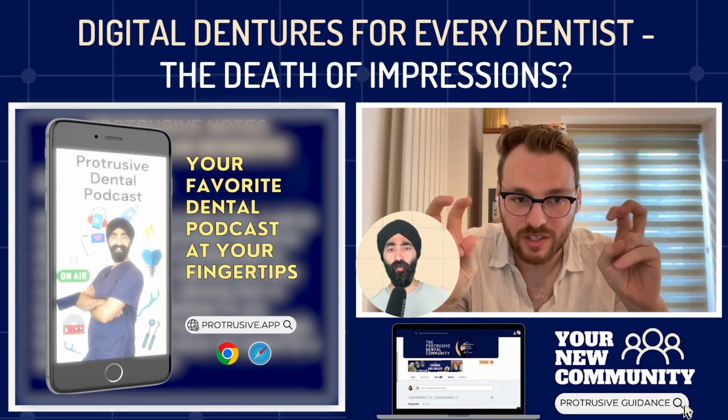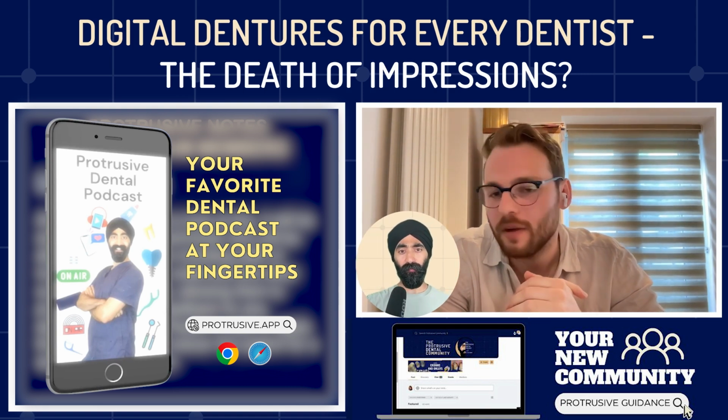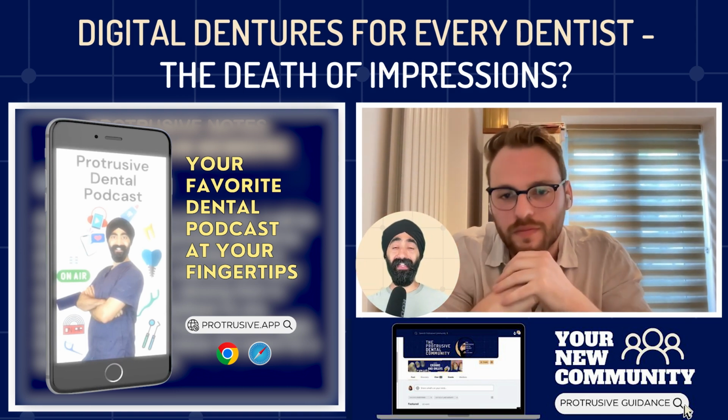So my secondary is a scan. So this is after you've done your guide planes, your rest seats, all adjusted, right? Yeah. My secondary impressions appointment is preps and scan. And scan again. Okay, great.